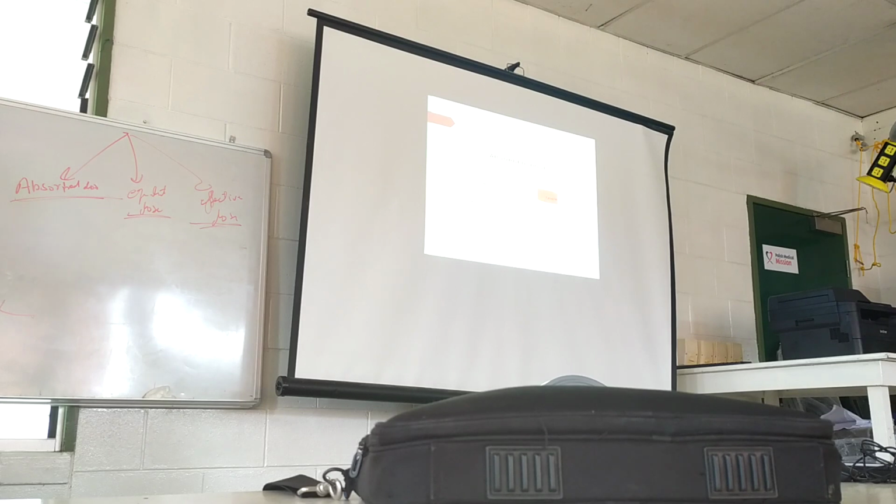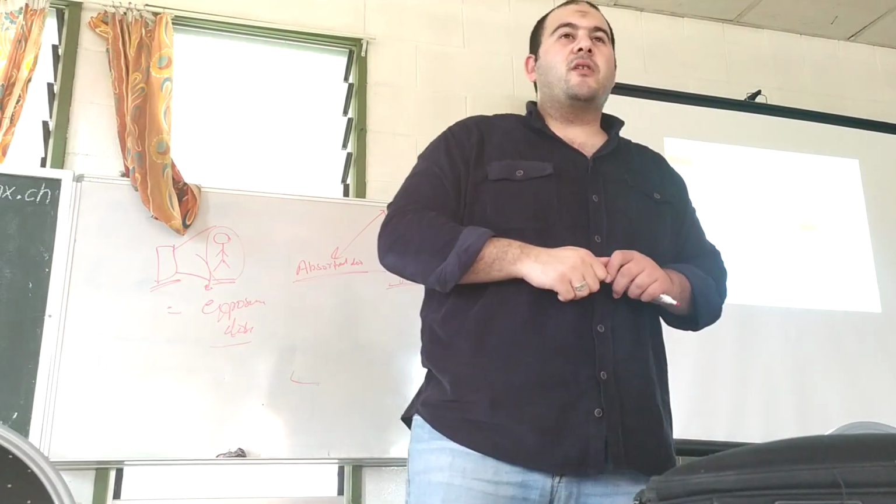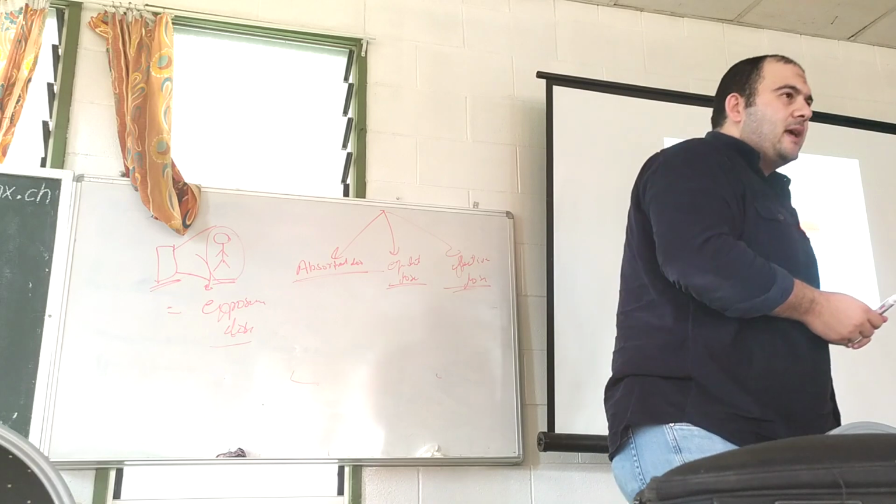If I have a source of radiation, this source will produce X-ray, and you are here. So now you are exposed to radiation. This radiation coming out from the X-ray tube causes ionization of the air. This ionization will be measured to produce the exposure dose. So now you are exposed to a certain value of radiation, but does your body absorb the same value?